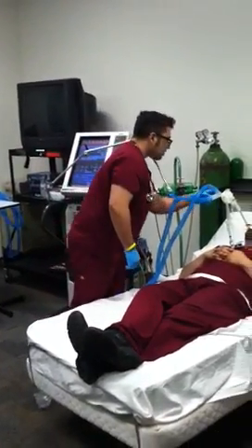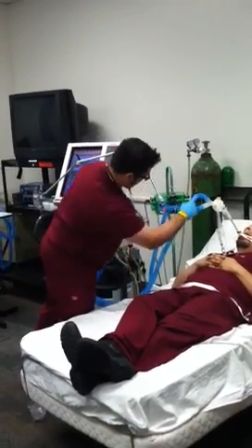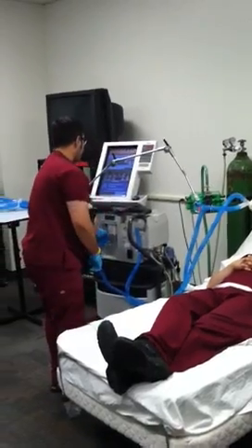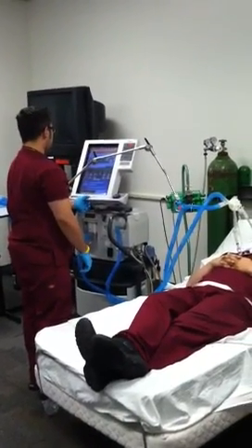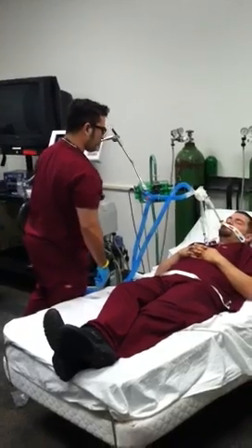After attaching the new circuit, he's going to test the equipment. He tests his new equipment for leaks and ensures circuit integrity when alarms silence themselves. He then connects the patient to the ventilator, which he has done.